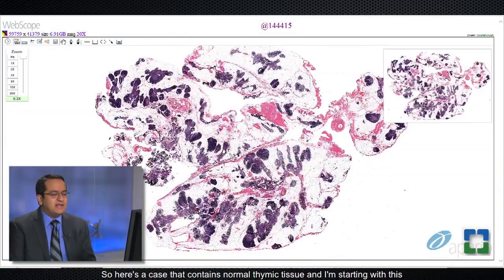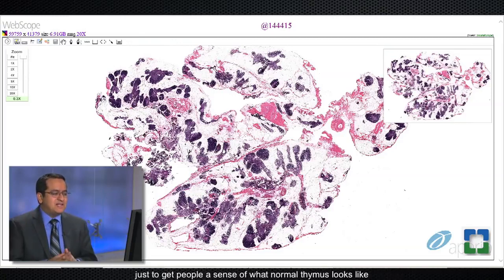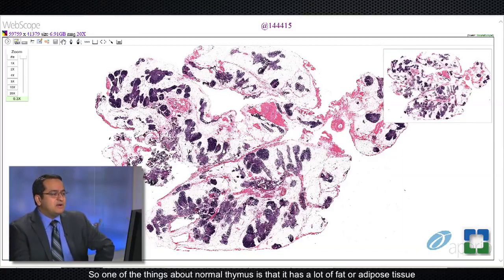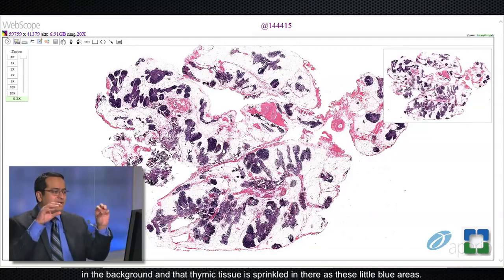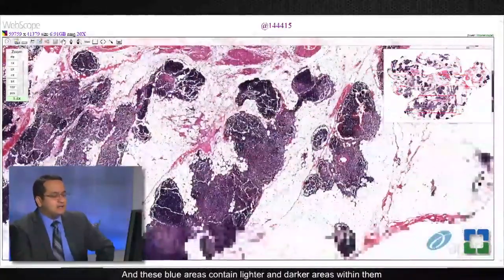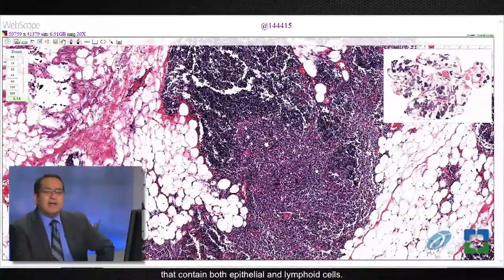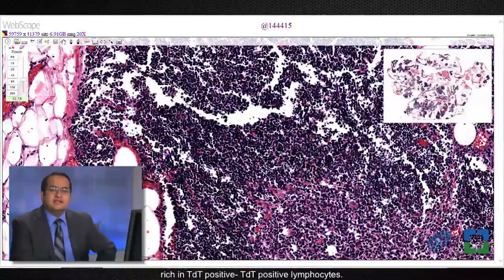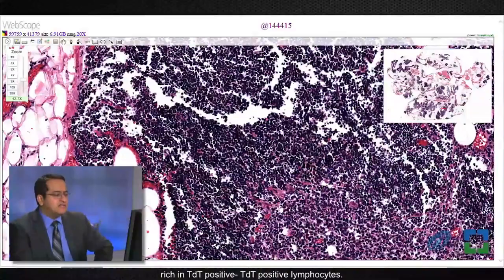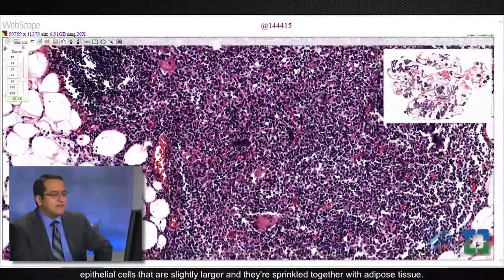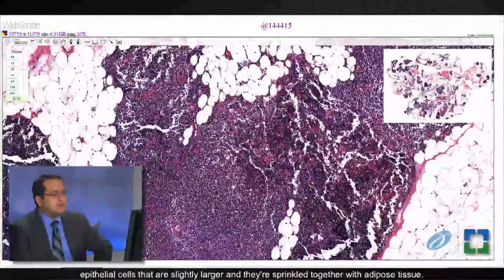Here's a case that contains normal thymic tissue. I'm starting with this just to get people a sense of what normal thymus looks like, so that when you see abnormal thymus you'll see what the difference is. One of the things about normal thymus is that it has a lot of fat or adipose tissue in the background, and thymic tissue is sprinkled in there as these little blue areas. These blue areas contain lighter and darker areas within them that contain both epithelial and lymphoid cells. The lymphoid cells in the thymic tissue are typically rich in TDT-positive lymphocytes — these are immature lymphocytes that occur in the normal thymus — and they are mixed with epithelial cells that are slightly larger, all sprinkled together with adipose tissue.